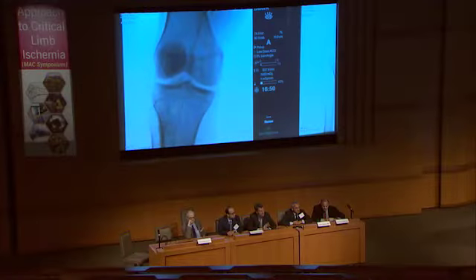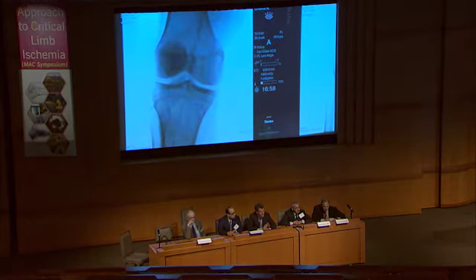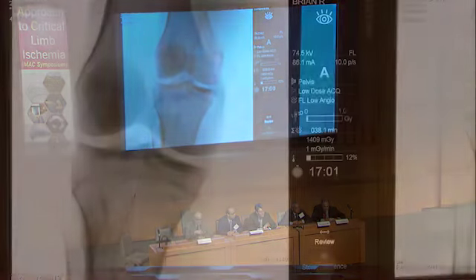I don't think this is an ideal case. Obviously, when we start talking a few centimeters of calcium, that's one thing for atherectomy. When we're talking 45 centimeters of this kind of dense calcium, that's a different animal. So I'm going to balloon this now.